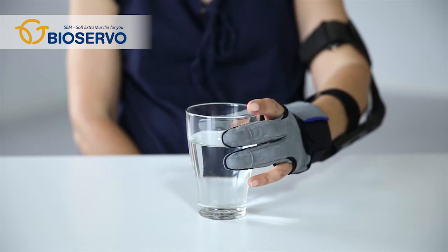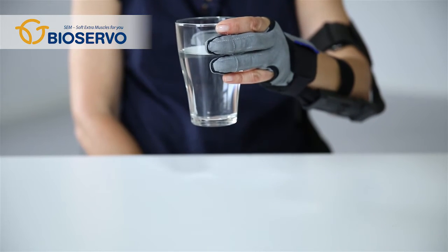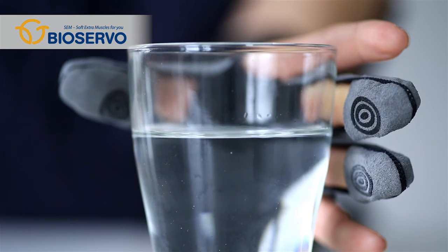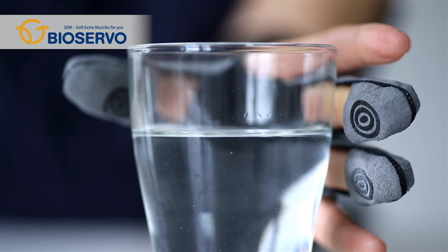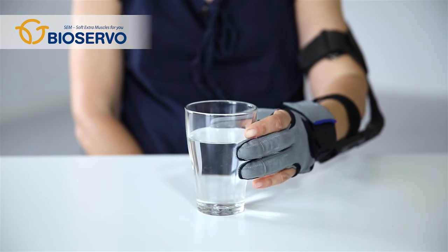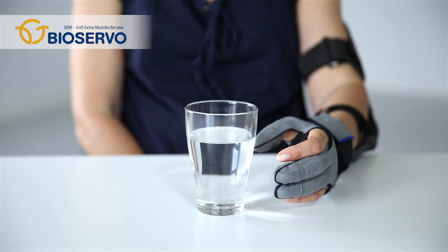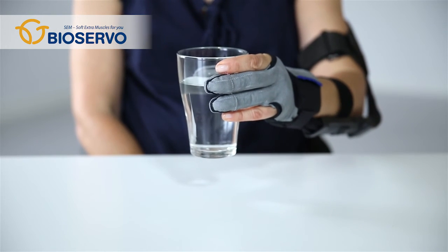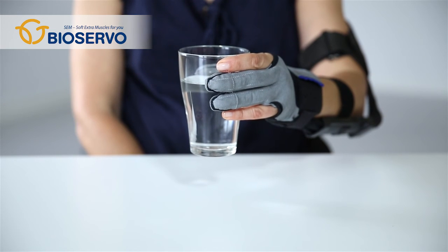Grasp an object as usual. When the object is held with the aid of the SEM glove, the touch sensors signal to the SEM unit which pulls the tendons so that the force in the grip is increased. The extra force applied by the glove is in proportion to the force applied by the user. Hence, the user can control, increase and decrease the extra force applied by the SEM glove. You can hear the sound of the motors working, confirming that the SEM glove is activated.